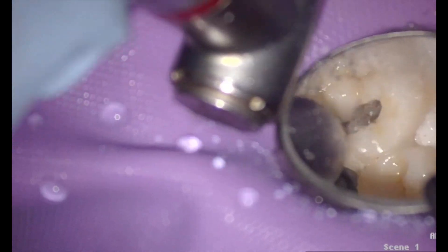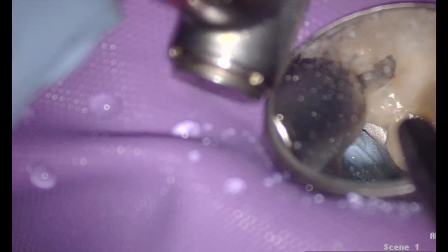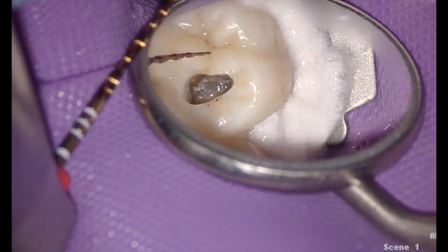So what I'm doing in this calcified case — there's more going on than just drilling into the tooth. I'm actually watching where I'm going. I'm about three millimeters from the mesial marginal ridge, sticking close to the center of the tooth, keeping the angulation along the contour of the mesial part. I also measured the cutting diamonds on the burr — it's seven millimeters — so I'm watching that as we go.